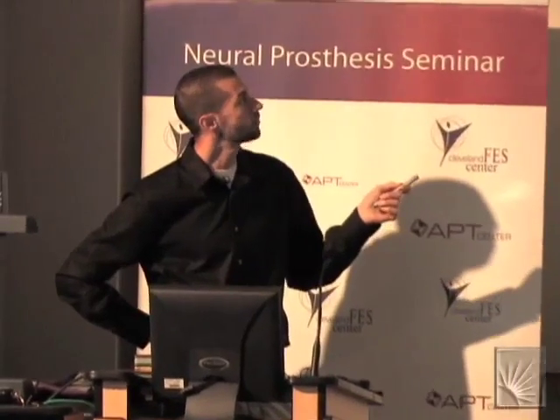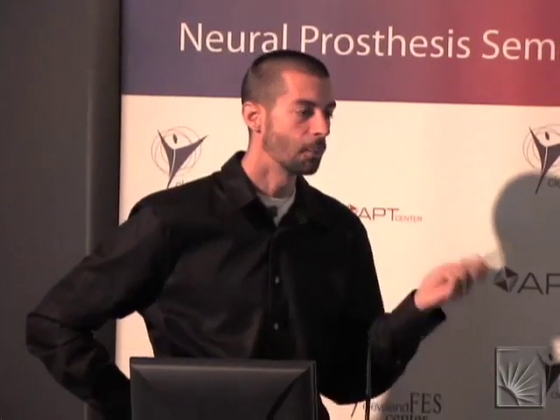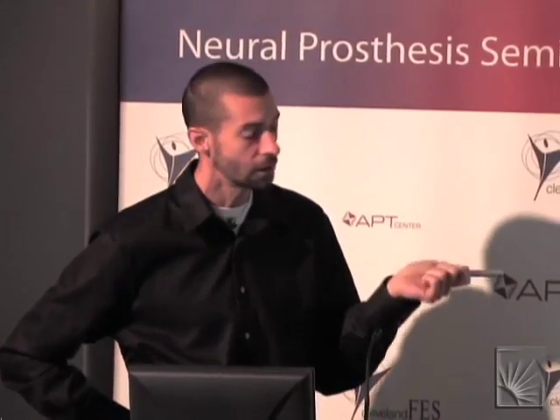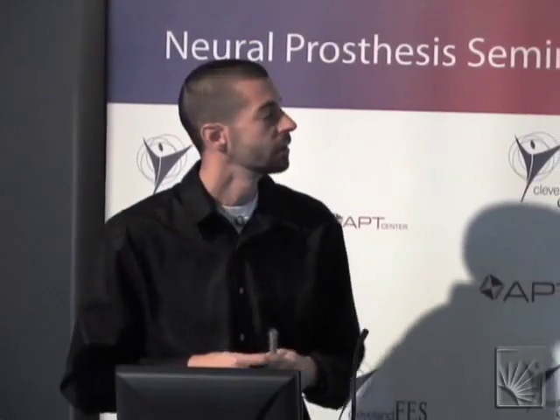And so we also know that if you put deep brain stimulators in the internal segment of the globus pallidus, you get almost identical therapeutic benefit to electrodes in the subthalamic nucleus. So the idea is that maybe STN DBS is just a different form of GPi DBS, and it's more in a fiber tract, which, as pretty much everyone in this room knows, is easier to stimulate than a nuclear bundle.